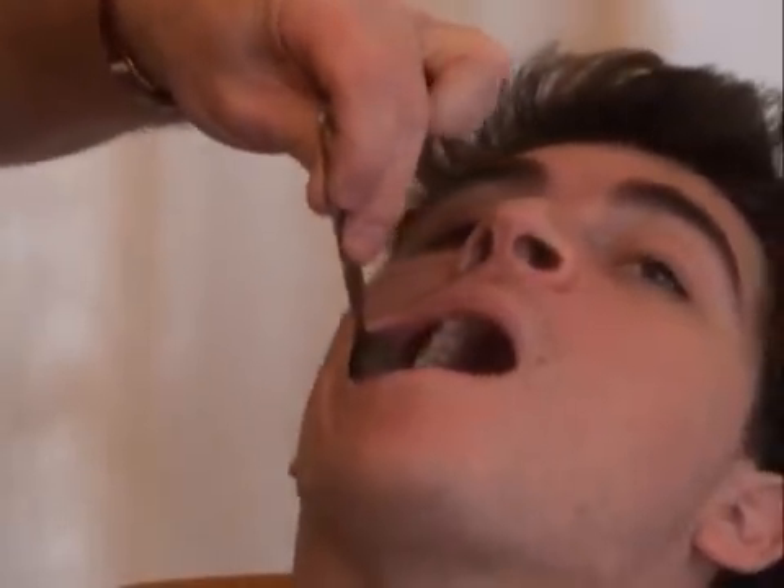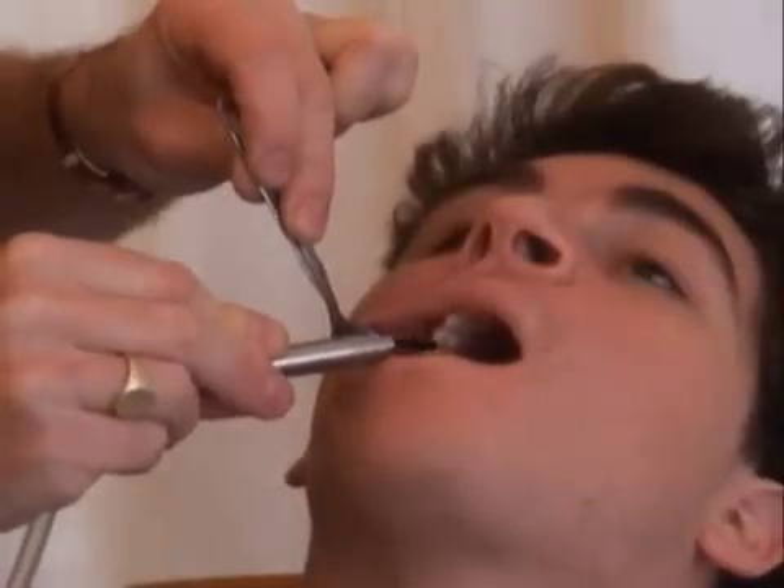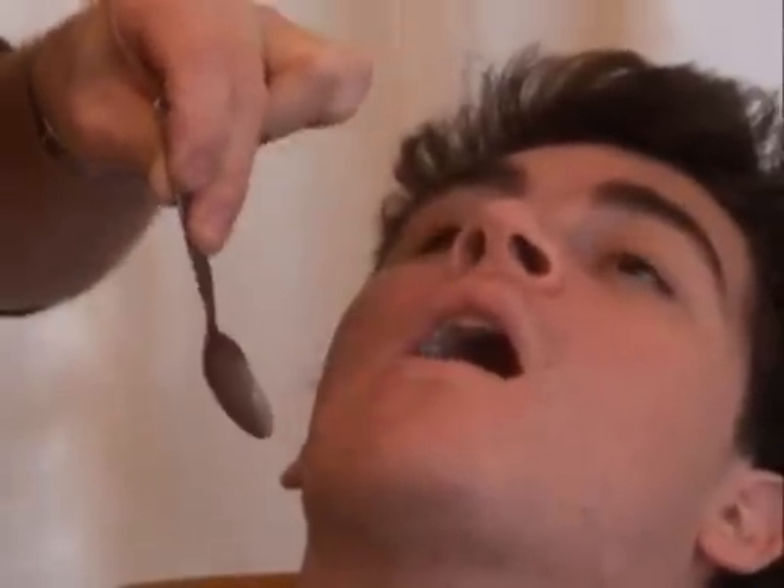I'm going to start off doing a very simple surface application. We're going to treat the biting surfaces of these three teeth — the two premolars and the molar at the back. We select 60 seconds.